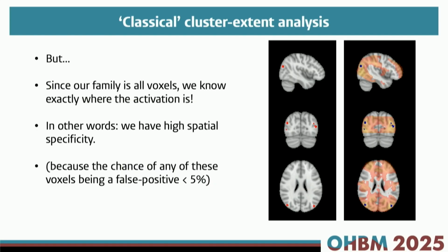That means that if we look up what anatomical region, what part of the cortex, is actually active, we can make a pretty good statement about this: in this task, this is the activation that was there.